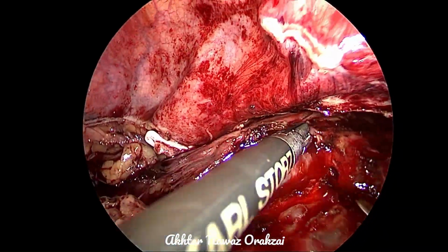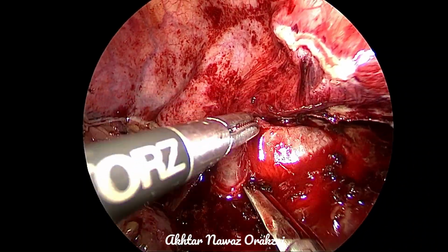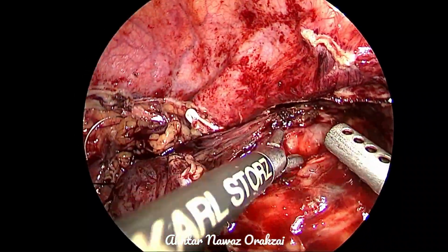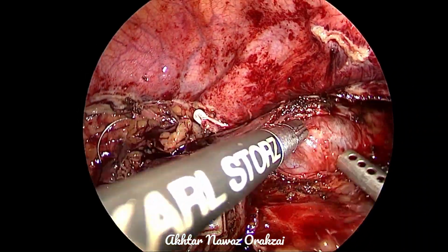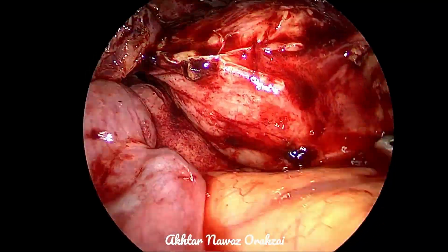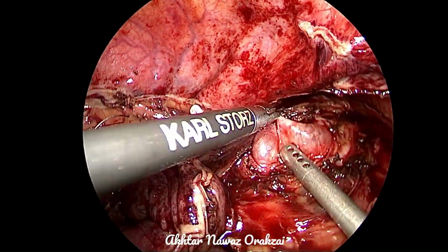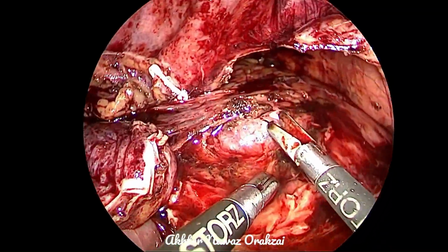Some more mobilization of the mucosa from the detrusor. Now comes the other side. Our forceps is traumatic. A little bit of washing and then using suction for the dissection. So our forceps is traumatic, and it may make a hole in the mucosa, but I think the tunneling is enough, although the length may not be enough, but it is wide enough. So even if the mucosa is open, it doesn't matter, as we are going to open it anyways. So enough of mobilization is now there.